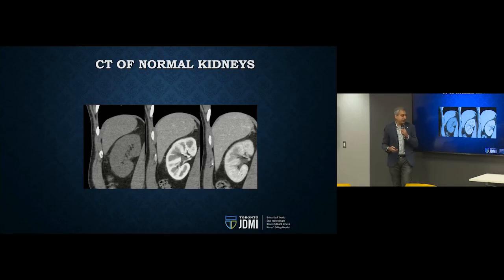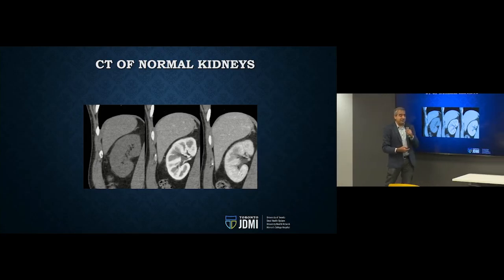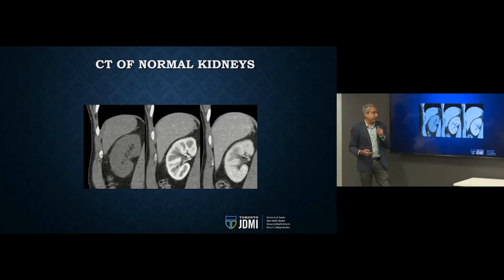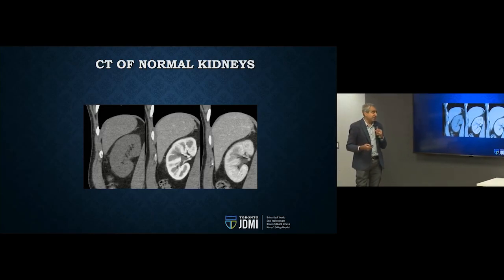And patients like to use the word dye. So it's the dye that's injected in relatively fast and hard volumes to be able to raise the density of any place in the body where blood flows. And so what we do in CT is we take this large volume of contrast and we inject it very quickly through a pump into the veins.